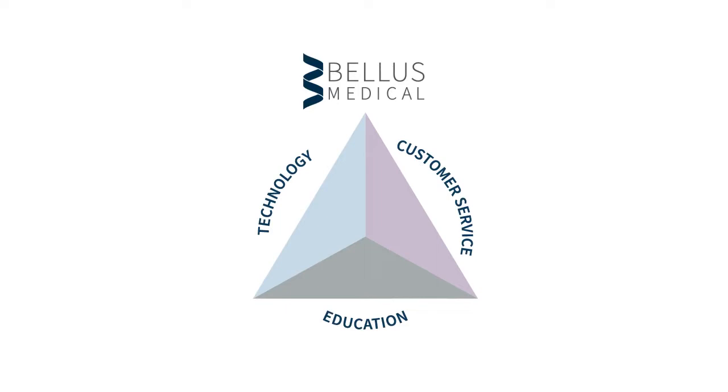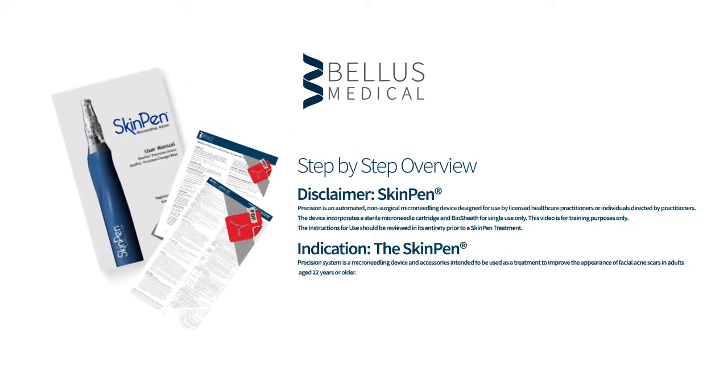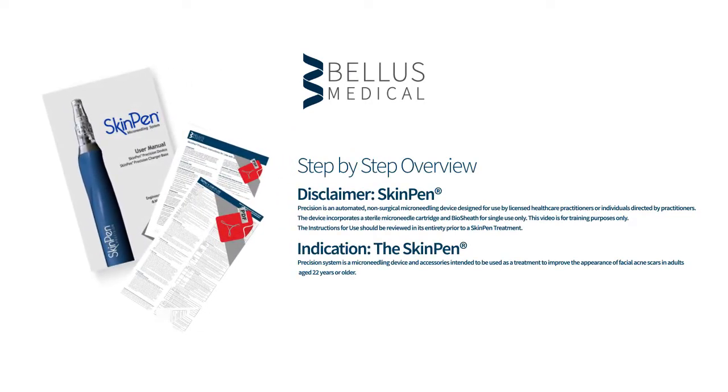As part of our ongoing efforts to provide on-demand education, we offer this step-by-step video guide to a SkinPen treatment, following the FDA-cleared instructions for use. The SkinPen Precision System is a microneedling device and accessories intended to be used as a treatment to improve the appearance of facial acne scars in adults aged 22 years or older.